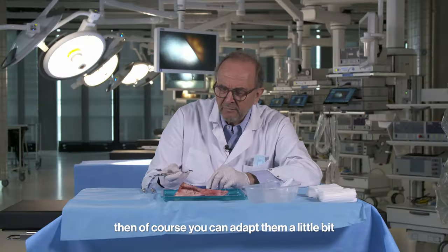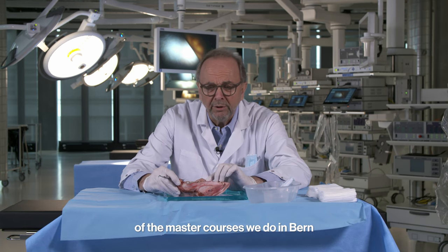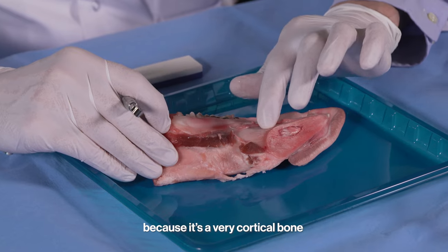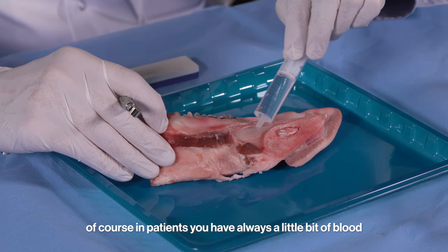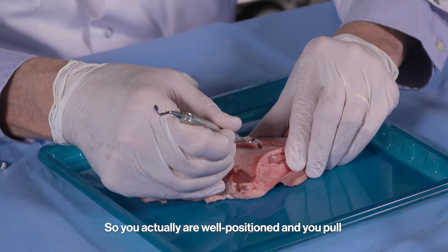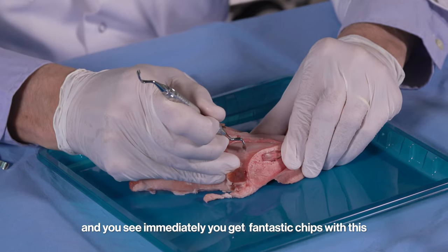Now how do we use them? Here is a pork mandible we use in our surgical workshops — the master courses we do in Bern. This is a pork mandible where we normally place an implant. I'll show you how to take the bone from the lingual side, because it's very cortical bone. I put a little bit of liquid here, because in patients you always have a little bit of blood. You are well positioned, you pull, and you see immediately you get fantastic chips.